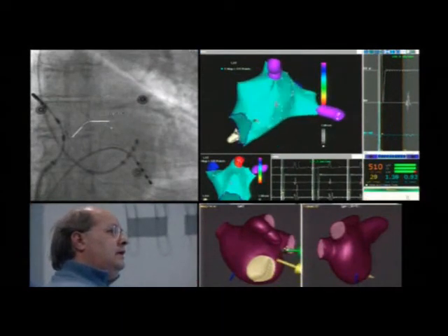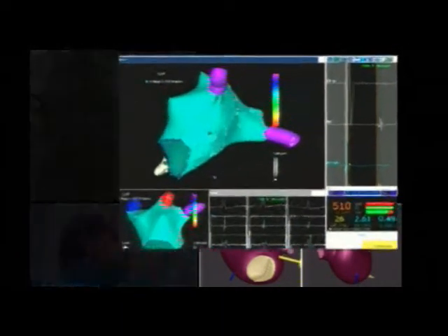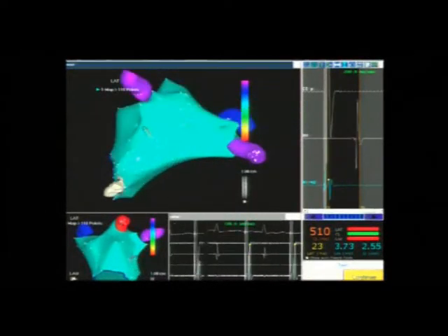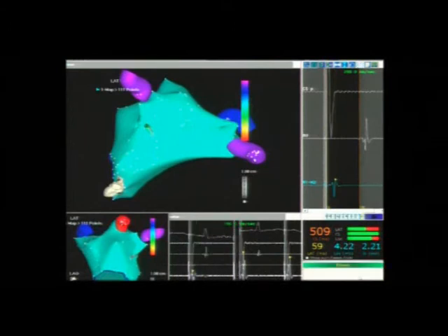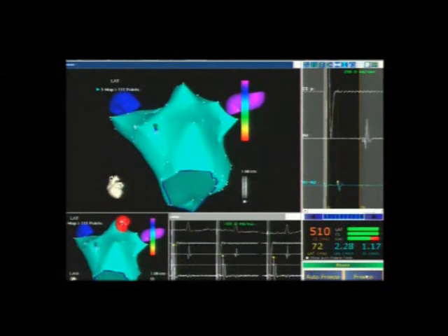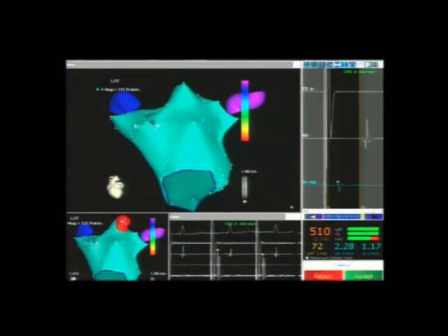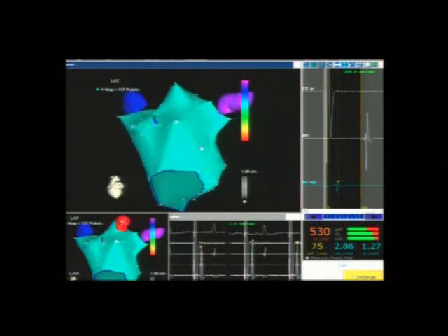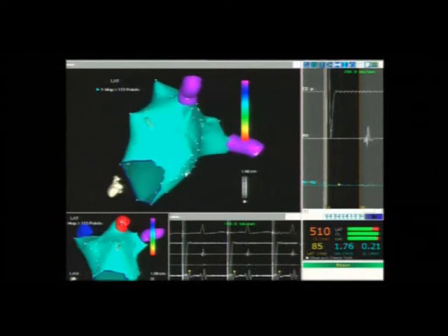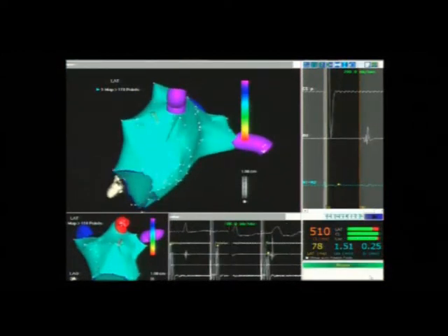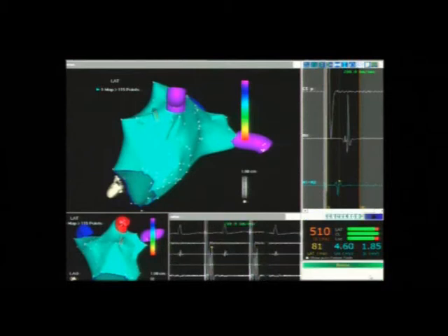To reach a single pulmonary vein, in most cases it is sufficient to select the preset function on the navigation screen for each pulmonary vein. If a pulmonary vein cannot be rapidly reached in this way, the operator can remotely guide the magnetic catheter to reach these sites.